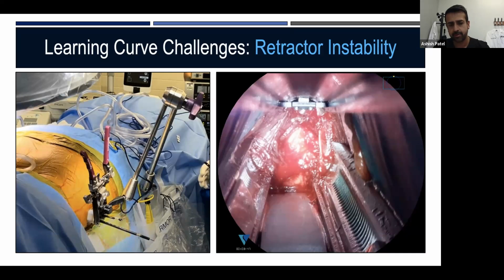Some people do it through anchoring the retractor to the disc space with two shims. I think that's a good solution. Some companies do it by placing the retractor on a robotic arm to increase stability. But we do know that retractor instability is a big problem. And there are two main methods of failure when we talk about retractor instability. There's the back and forth, the medial-lateral piston effect. When you are malleting anything inside the disc space, the spine moves away from you.